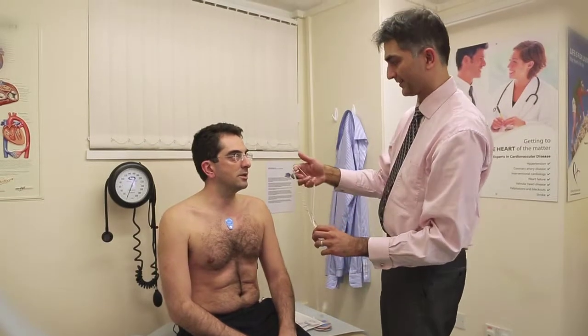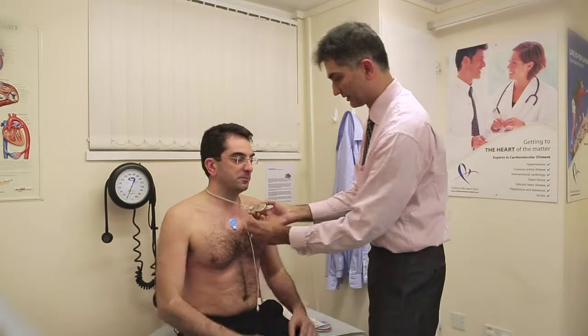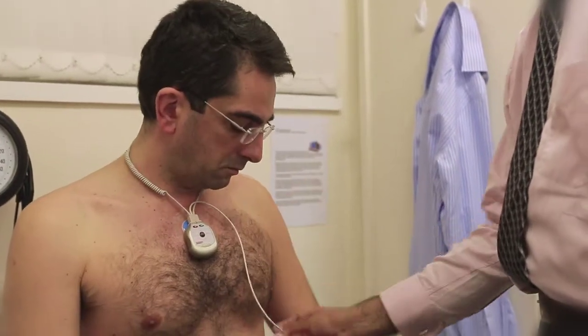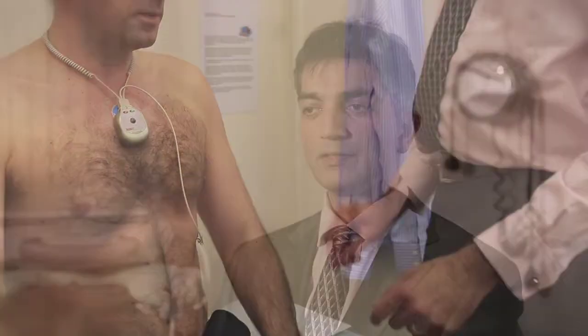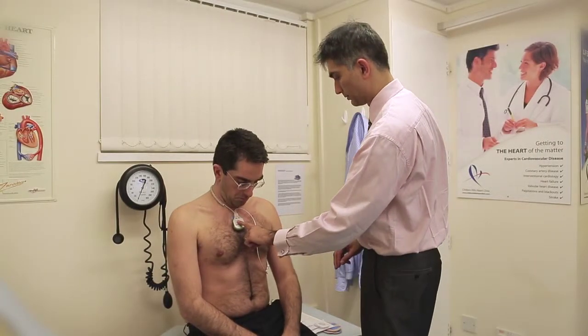One would expect the heart rhythm to be slow and regular at night when the patient's asleep, and to be fast and variable during the day. If the patient's getting dizzy spells or is feeling faint, and if those symptoms are due to an abnormal rhythm of the heart, we should be able to pick that up on the monitor.